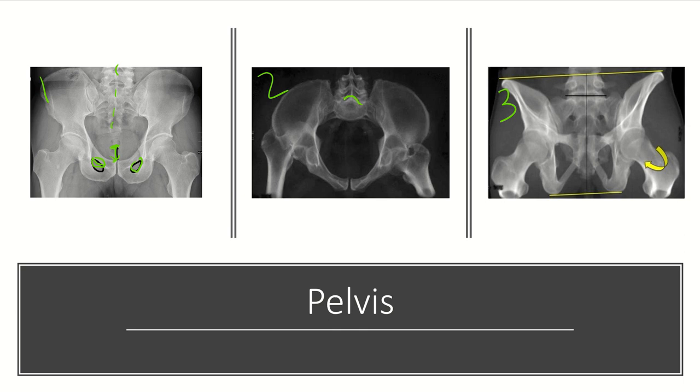On the pelvic inlet view, S1 should overlie S2. This is a good view to assess internal and external rotation of the pelvis, as well as anterior and posterior translation of the SI joint. On the pelvic outlet view, the pubic symphysis should be relatively at the level of S2. This is a good view to assess for vertical shear injuries, as well as flexion or extension of the pelvis.